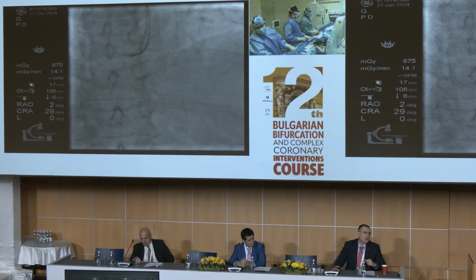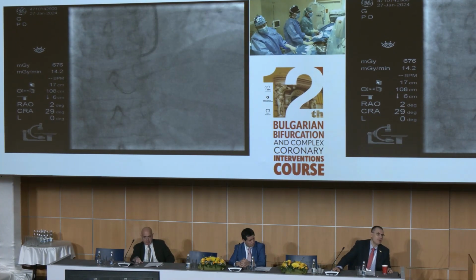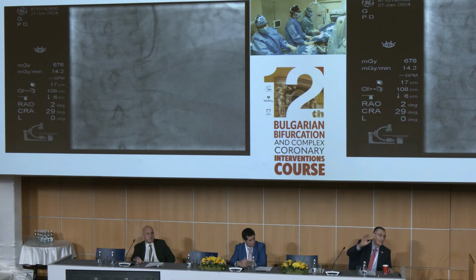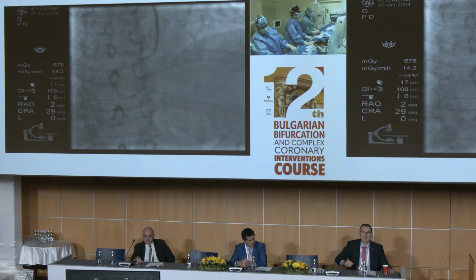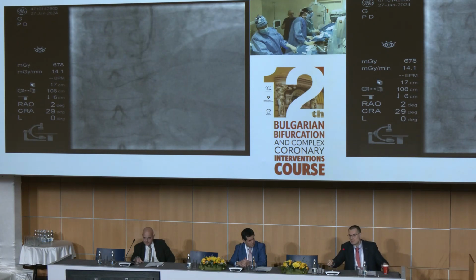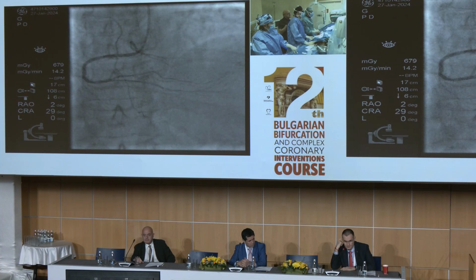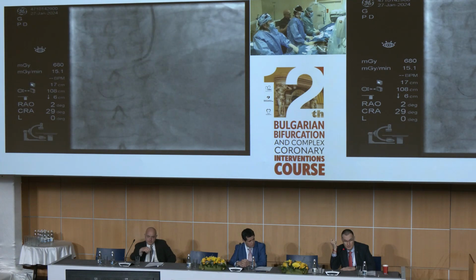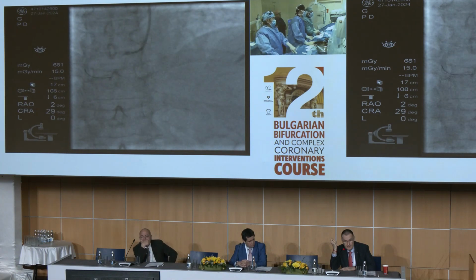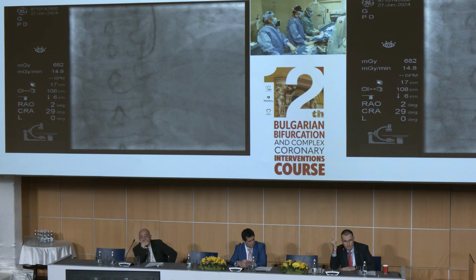You want to zoom or not? No. Just a small injection. So there is also a tight bifurcation stenosis on the LAD, and so that's it.